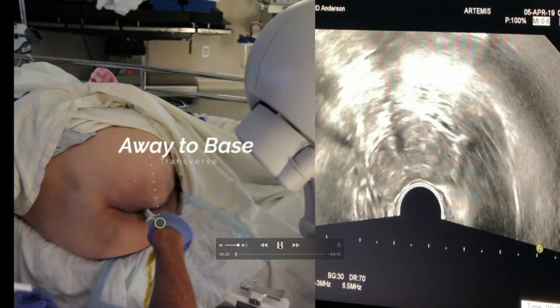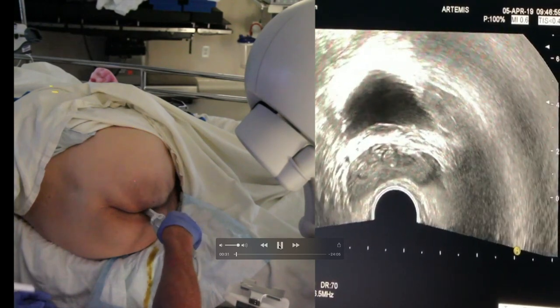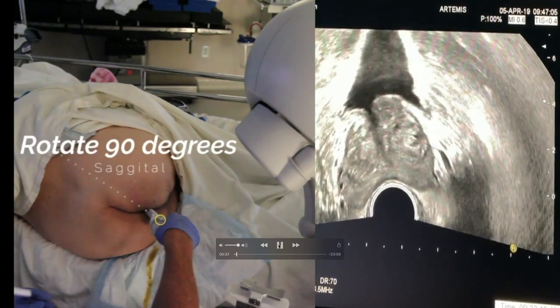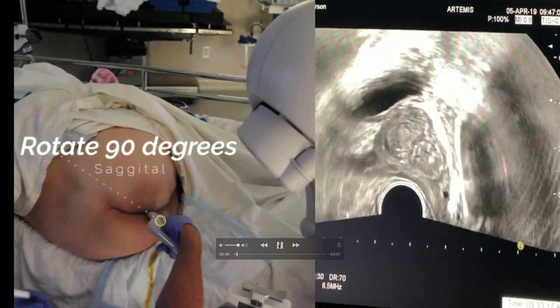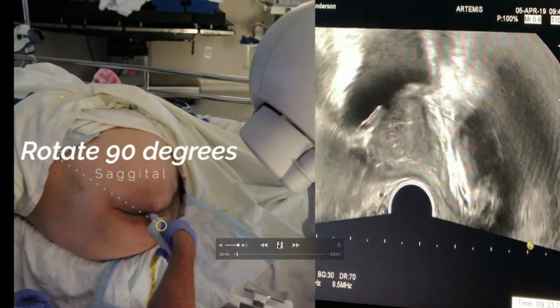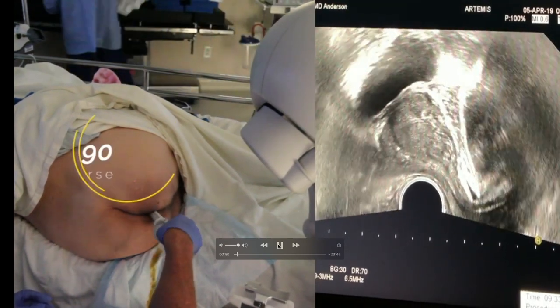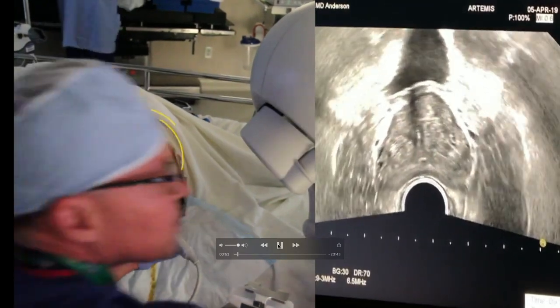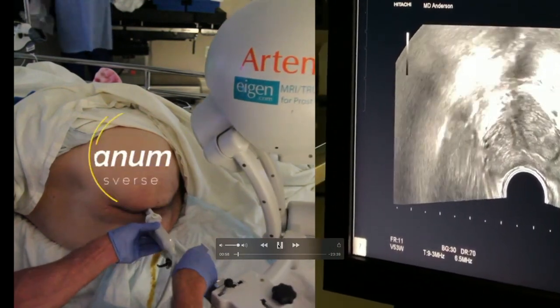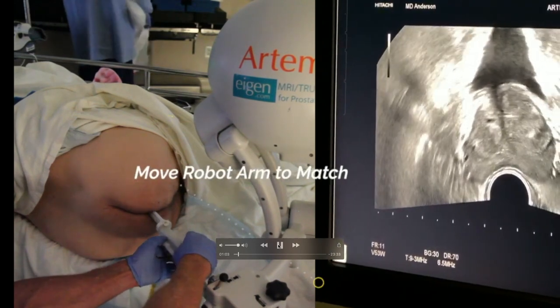The first thing about the Artemis device is that it is an end-fire probe, and a lot of physicians are not familiar with the end-fire probe. You have to learn how to move it: pushing the probe away to get to the base, pulling it back to get to the apex. There's only a single chip in there, so you have to turn it to get to the sagittal view, and raise your hand up to get to the left side of the prostate, and drop your hand down to get to the right side. When I bring fellows in, I have them put their hand on there and we scan the prostate together, mostly to get them used to using an end-fire probe.